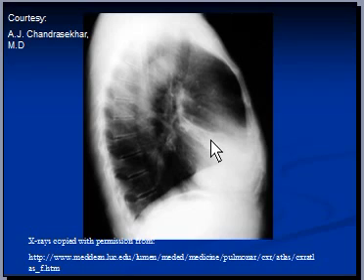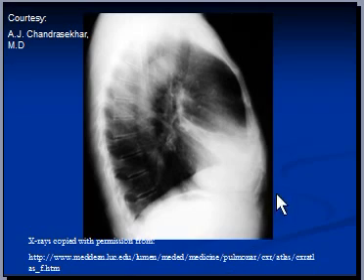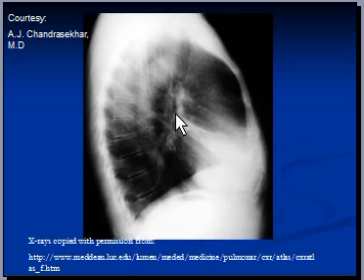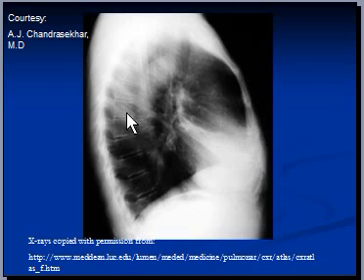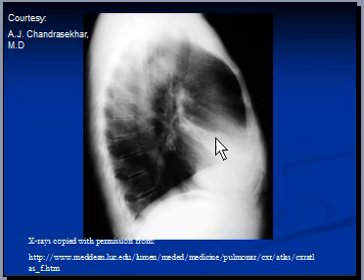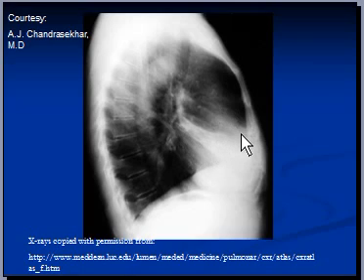This is a collapsed right middle lobe. How do you differentiate a collapsed lobe from consolidation? One feature is loss of volume, which is evident in this case — the right middle lobe has become smaller. The second feature is displacement of fissures. The horizontal fissure, which should normally be here, has been displaced. The oblique fissure, which should normally be somewhere here, has also been displaced — the horizontal fissure has moved inferiorly and the oblique fissure has moved up and anteriorly as well.